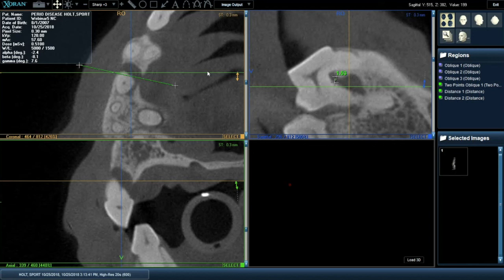In practice, what I've seen so far is most people, because of the speed of the imaging, will take the VetCAT scan and then go ahead with treatments. There are a few people who intake the patient in the morning, do sedation. Remember that the patient has to be sedated, so some sort of lighter sedation, take the scan, do a diagnosis, present it to the owner within the same hour or so, and then go ahead with treatments that day or shortly thereafter.